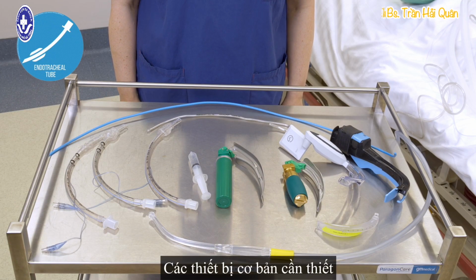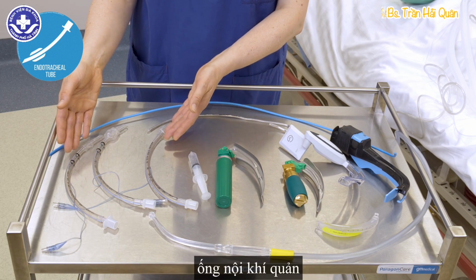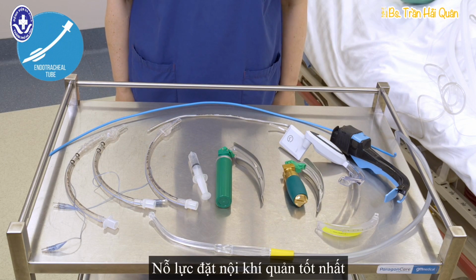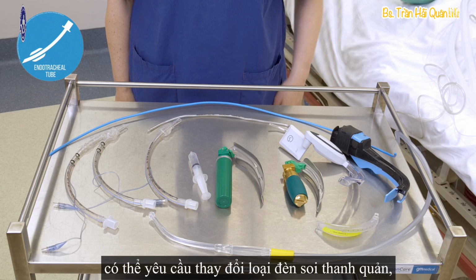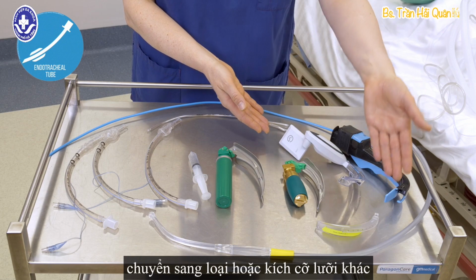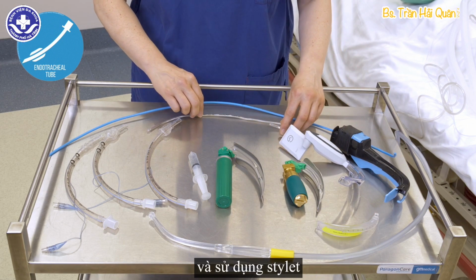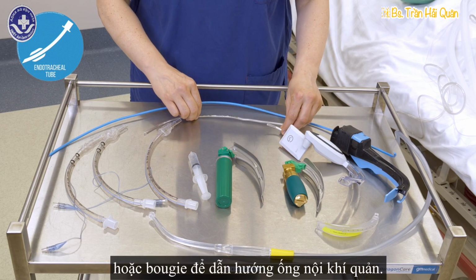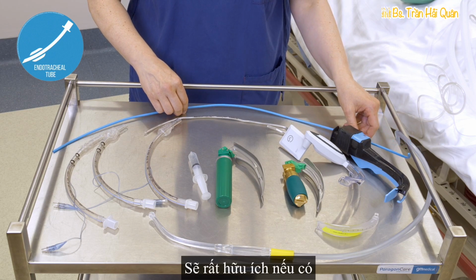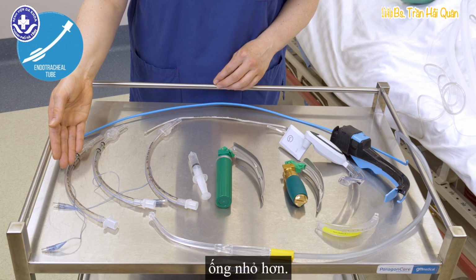The basic equipment required for intubation includes a laryngoscope, endotracheal tube, and suction. A best attempt at intubation may require a change of laryngoscope type, moving to a different blade size or type, and the use of a stylet or a bougie to guide the endotracheal tube. It is useful to have endotracheal tubes of different sizes, in particular a smaller tube.